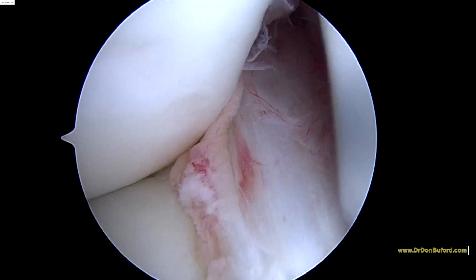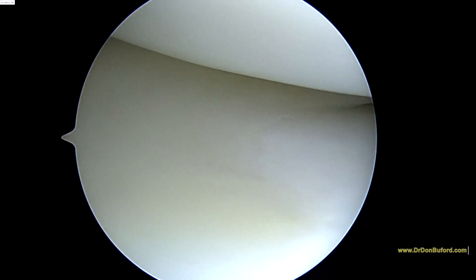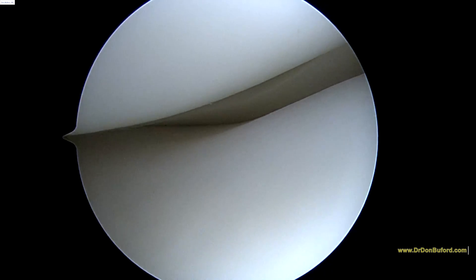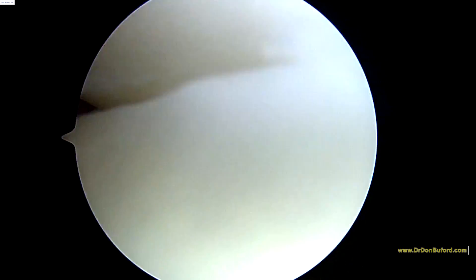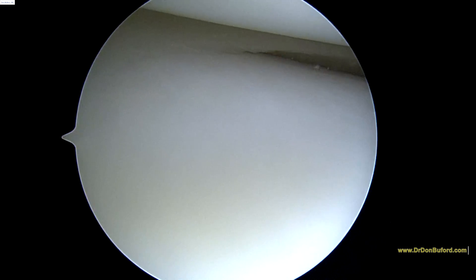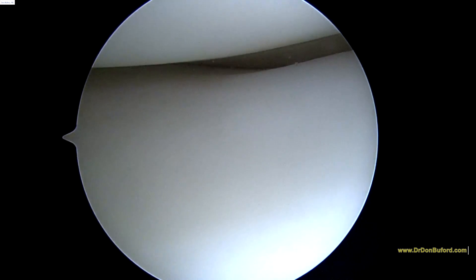So the next step is we're going to go ahead and look in the lateral compartment. This is the lateral compartment — this is the outside part of the knee. These structures look good also. You can see the meniscus in the back. The articular surfaces look great. There's a lateral gutter over there a little bit. So the meniscus is checking out fine. We'll keep looking and show you some more in a little bit.